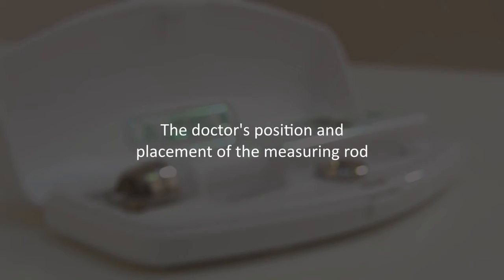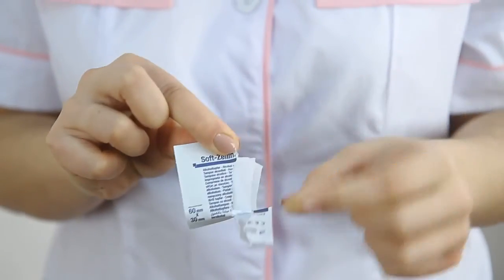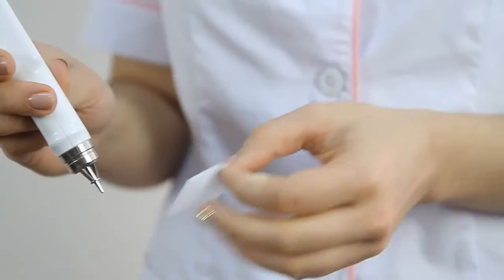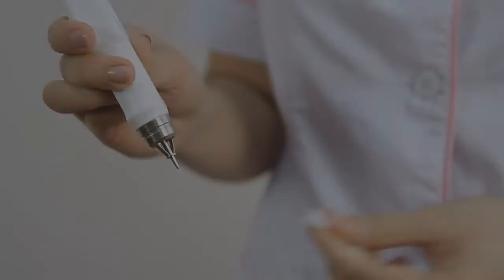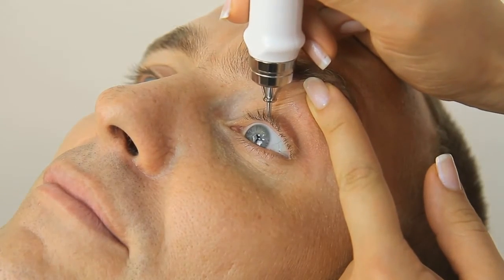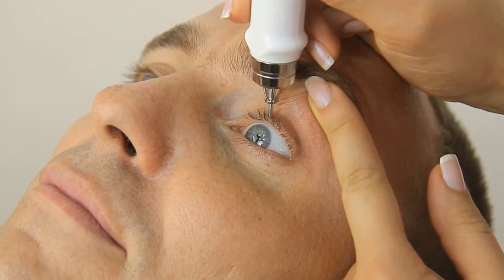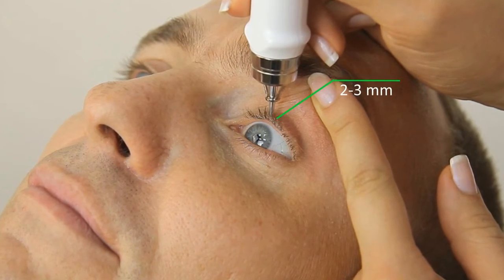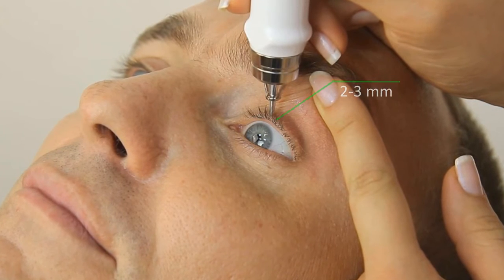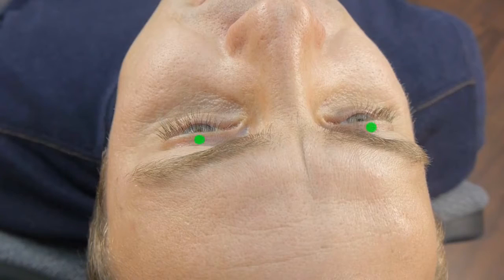The doctor's position and placement of the measuring rod. Please make sure to disinfect the protective ring and vibrator rod before each new patient. The hand holding the tonometer should rest against the patient's forehead. Place the tonometer rod 2 to 3 millimeters above the ciliary margin of the eyelid. Several measuring spots are recommended, which are convenient both for the doctor and patient.